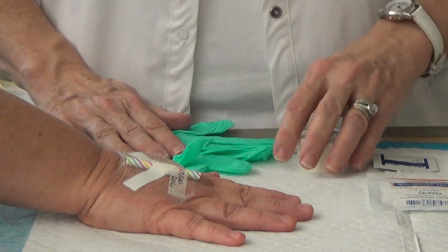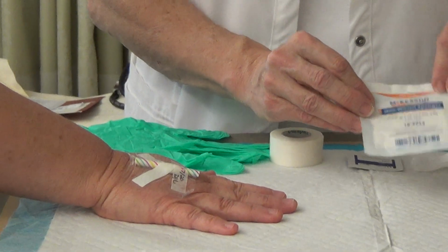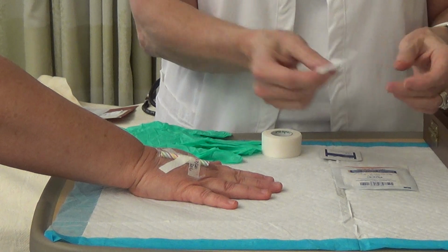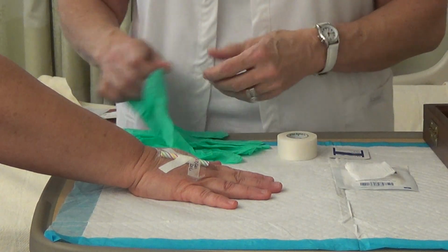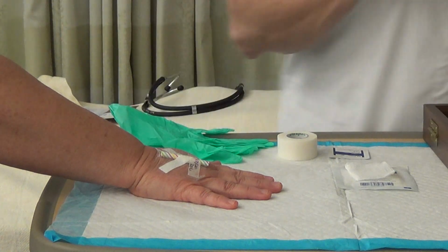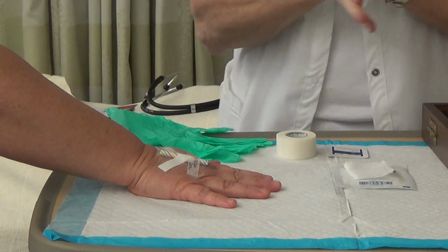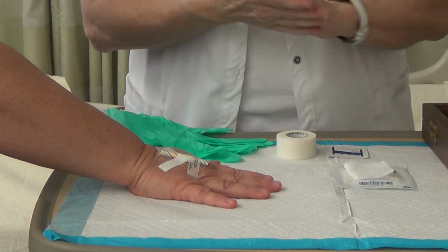So I have my gloves, I have tape, I have a 2x2 or a Band-Aid if you want to, but some people bleed a little longer if they're on anticoagulants, so I use a 2x2, and I have one opened already that I'm going to use, and I have an alcohol swab just in case. Now with these IV sites, hand hygiene first. So here's my hand hygiene. Anytime you put your gloves on and anytime you take your gloves off, you're doing hand hygiene.